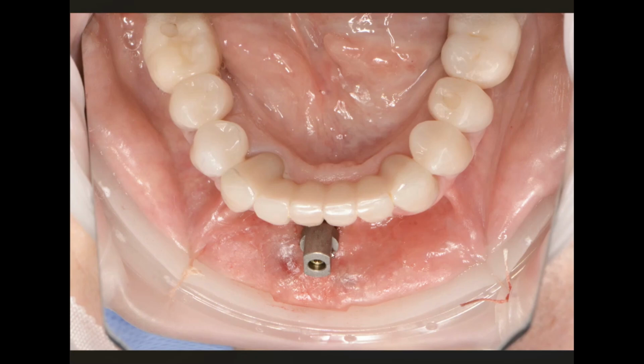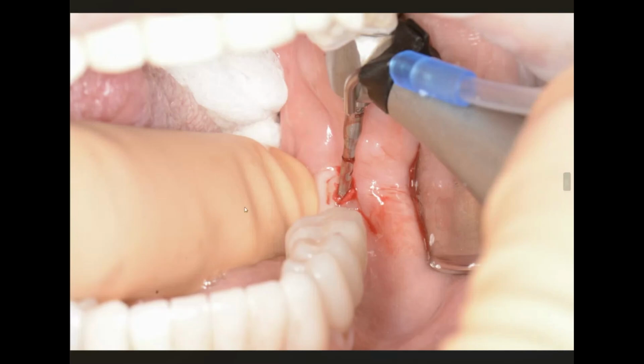This is the Atlantic Implant Marker, again, sold at LA Labs. I get no royalties from this whatsoever. But we put this fiducial on, and now we're ready to scan. We're ready to scan to the back left corner and then to the back right corner, and then we're ready to go. All right.